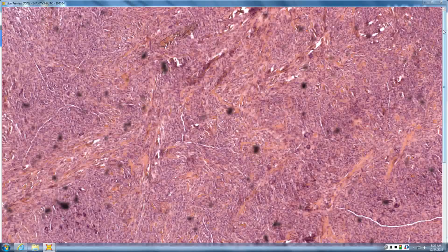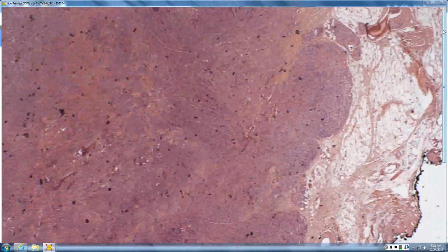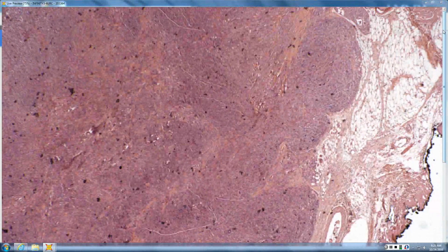So a lot of them are on the periphery, not so much in the center, which goes with an XG, xanthogranuloma. What's missing for necrobiotic xanthogranuloma? The necrobiosis, right? Which in NXG would tend to form X's of red, advertising itself as an NXG. Importance of NXG, if it were associated, would be what? Like a kappa gammopathy. Kappa gammopathy, absolutely.